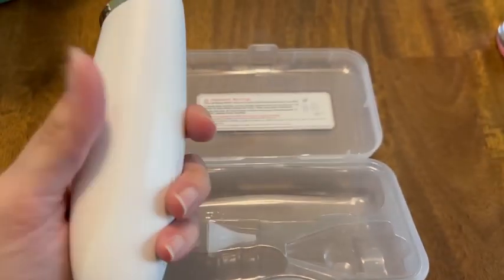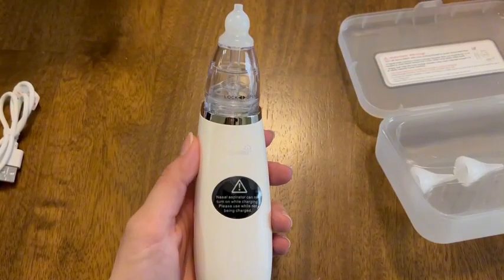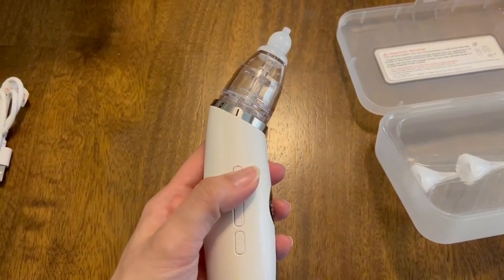The unit itself is a fairly good size, so you can see me holding it in my hand. I can have a good grip on it while I'm trying to get baby to stay still. Easy to use.